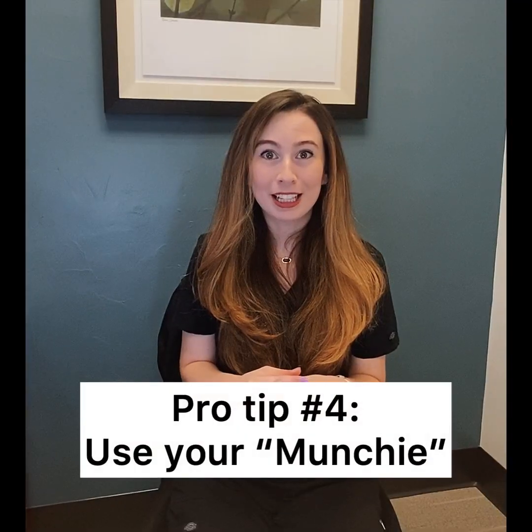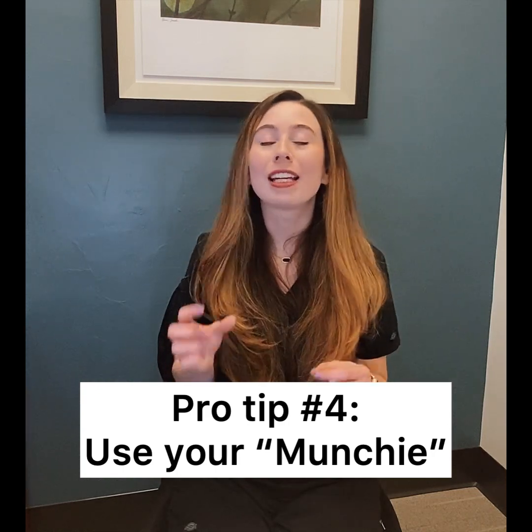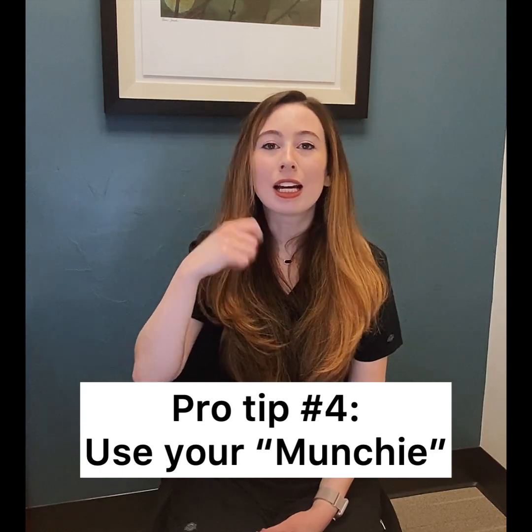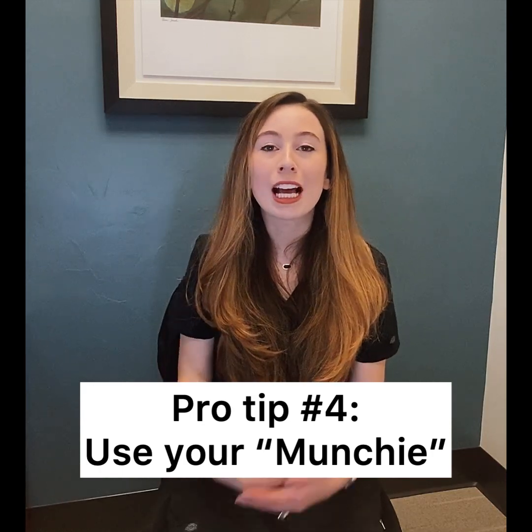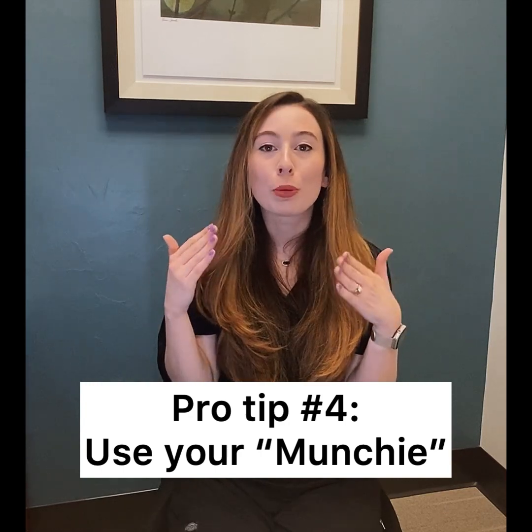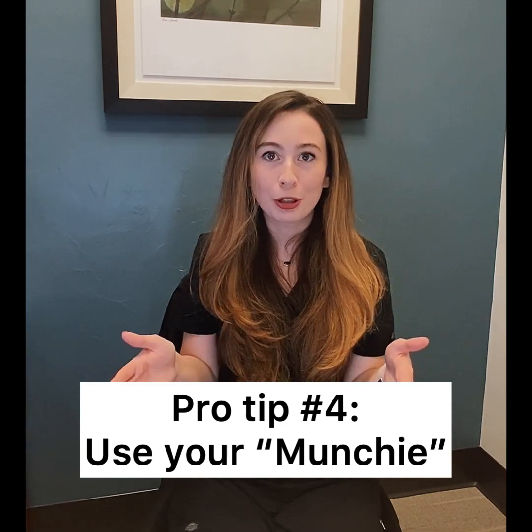My next tip is to use your Munchie. That is a small red triangle rubberized device that we gave you that you're supposed to chew on. That device is to be used 15 minutes a day and it helps your trays seat down further. The further your trays seat down, the more predictable your movements are going to be and the faster you're going to progress.